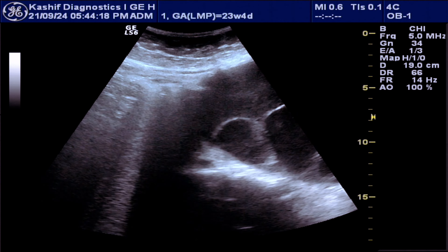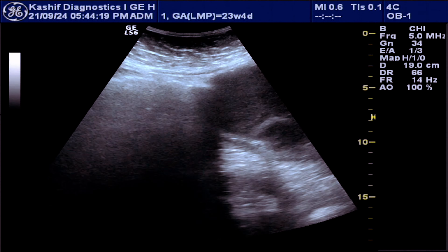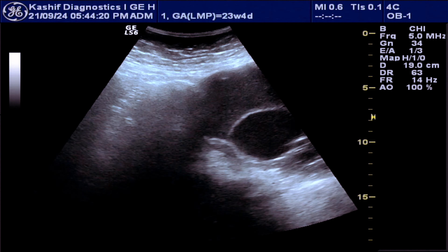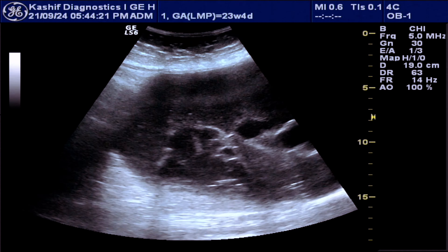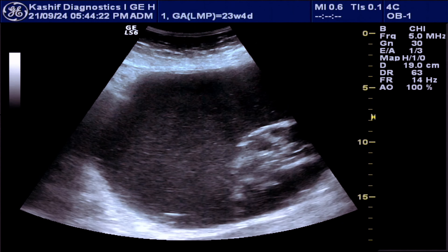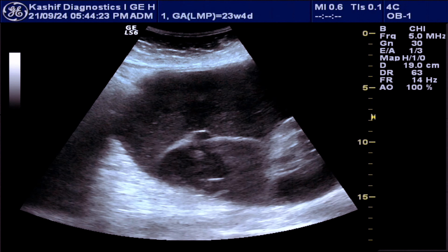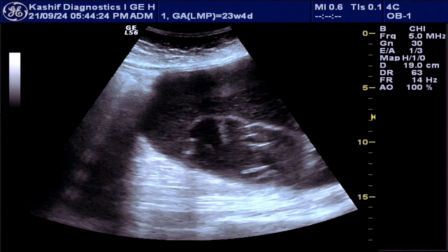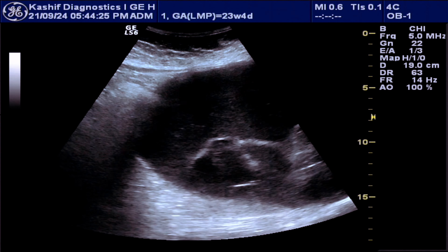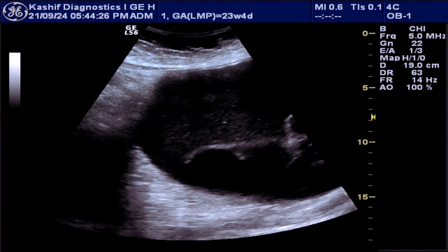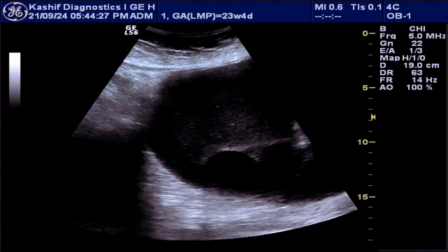This is a 34-year-old female presenting with abdominal distension. She has no pain, only fullness of the abdomen.